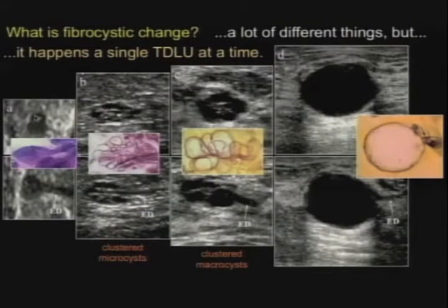As these acini enlarge, the walls between them become ruptured, so there are fewer, larger ones. And if they all rupture, then we get a simple cyst. Again, we think the simple cysts occur because the duct twists and obstructs the drainage of fluid. Normally there's a little twist to the ducts anyway, which allows them to expand, but if they twist too much, then they can obstruct and form a tension cyst. This is as benign as anything we find in medicine, and these are just normal.